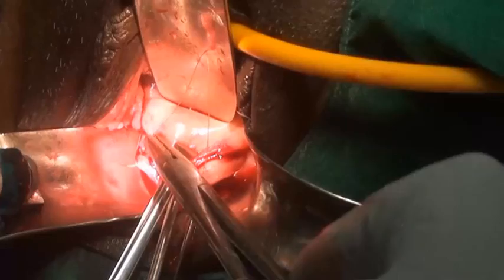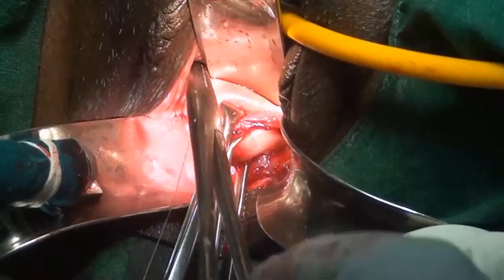At the end, the vaginal wall is sutured with the cervix and the surgery is finished. The suture material used is number 1 silk spun in 3 layers from Sutures India.